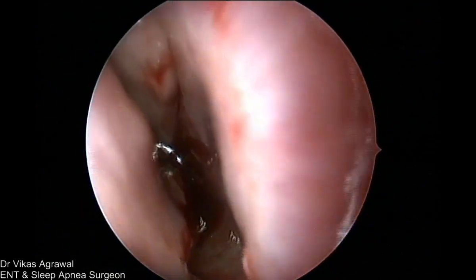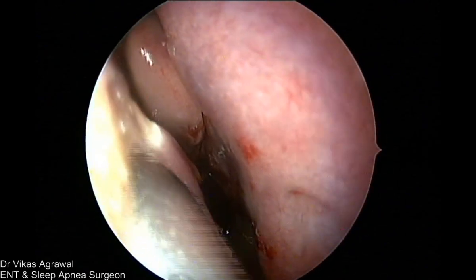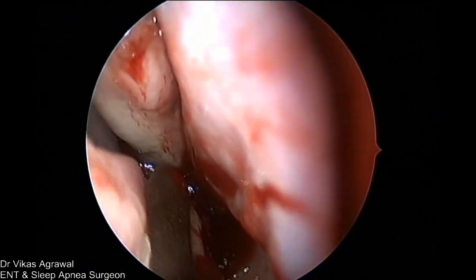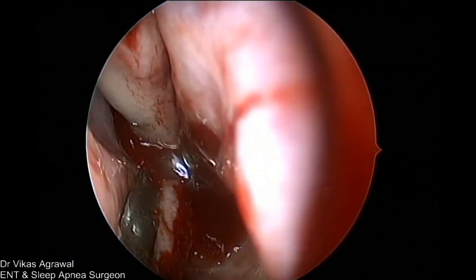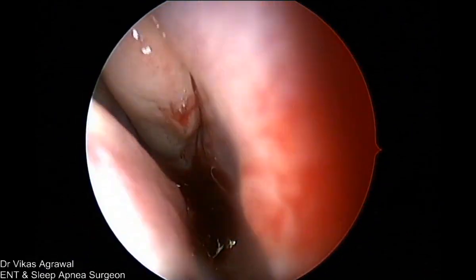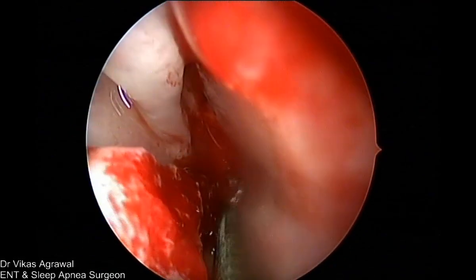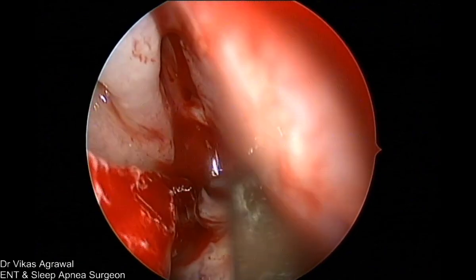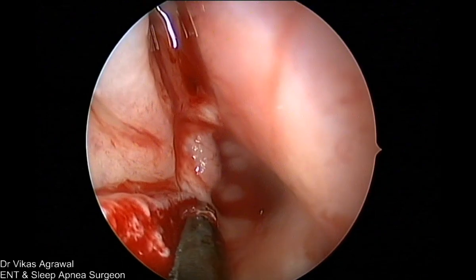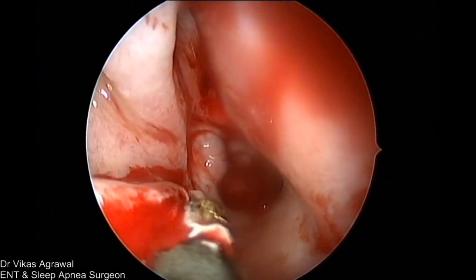will cauterize. But before that, so see, upper part of the anterior 1/3 we have done, lower part of anterior 1/3 we have done, middle part of the inferior turbinate will just out fracture. The moment you out fracture, you create a lot of space. So if we understand the inferior turbinate as 6 parts, we can give the patient an absolutely open nose without giving any chance for atrophic rhinitis.